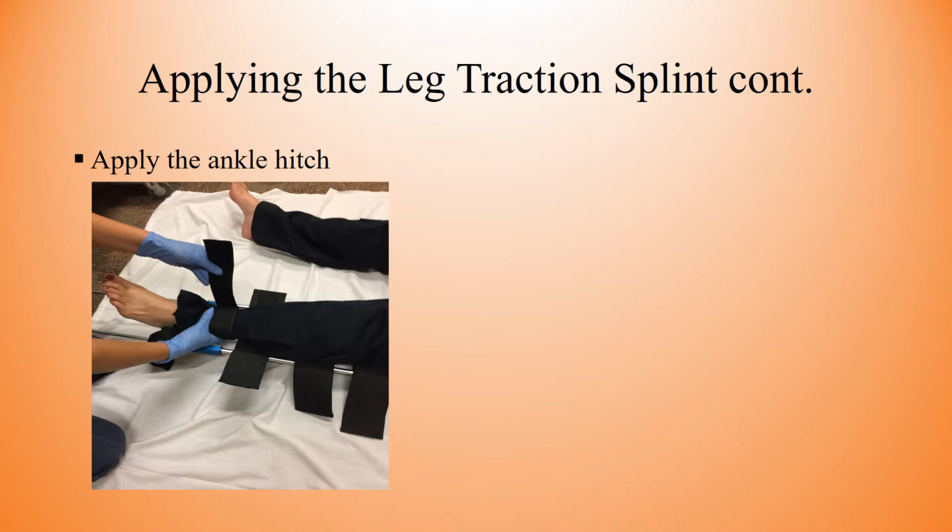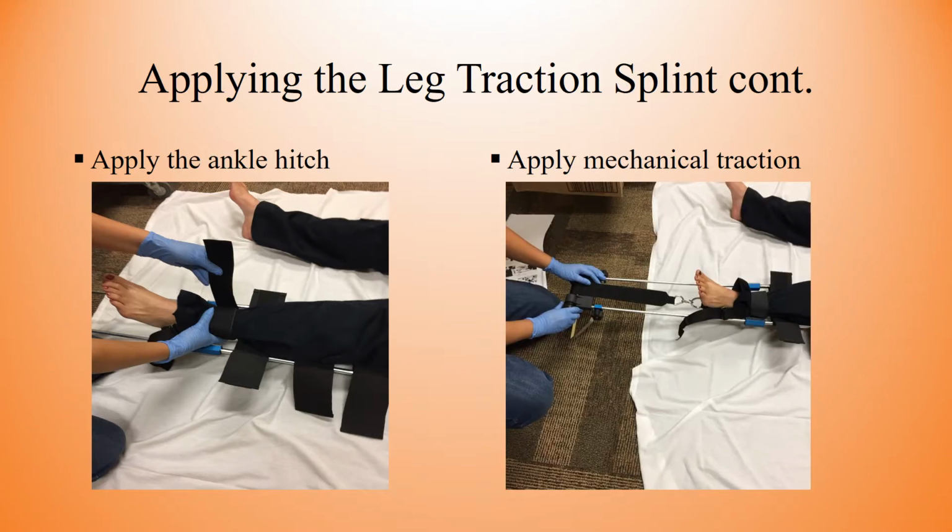Then you will apply the ankle hitch. And it doesn't show in this picture, but your partner will still be holding manual traction at this point. Then you will apply mechanical traction. And hopefully the patient will be feeling some relief shortly after this.